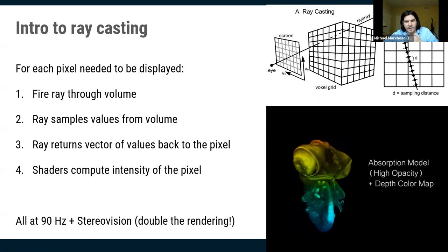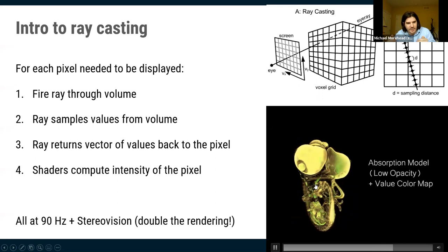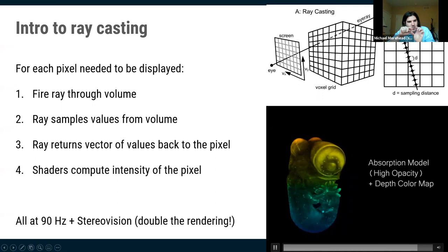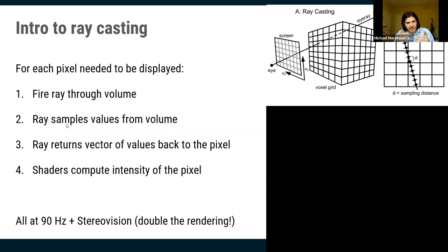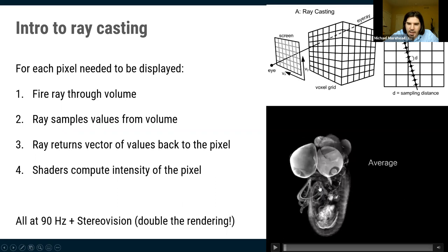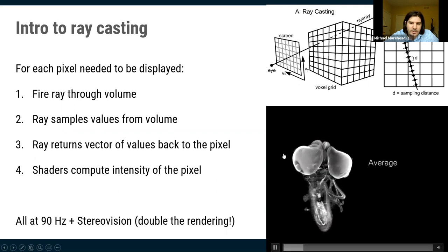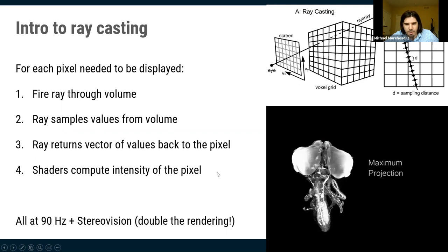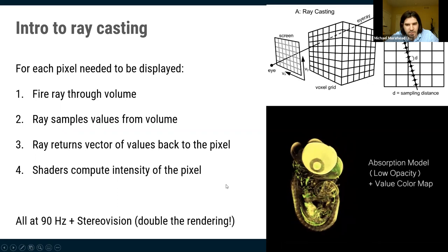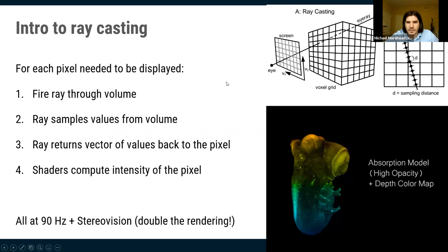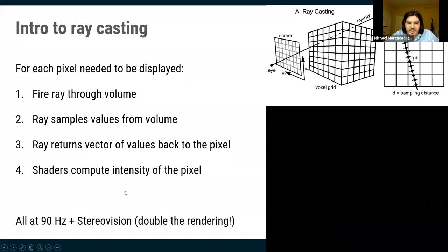A more sophisticated approach is the absorption-emission model, well studied in graphics, where each voxel both emits and absorbs light depending on applied settings. You can achieve an opacity slider that makes the ray stop when it hits something solid. This creates depth cues: with averaging or maximum intensity projection you can't tell when an eyeball is in front of a brain, but with opacity you can — and those depth cues are very important.